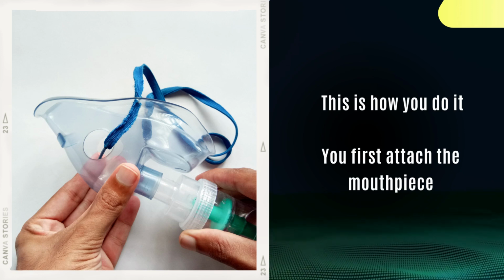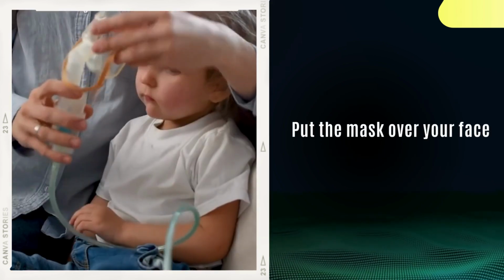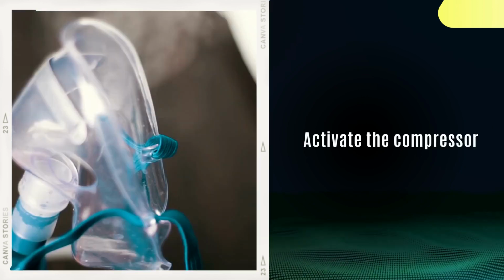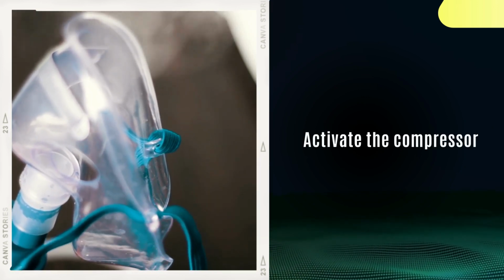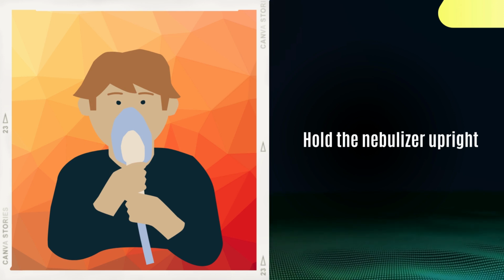You first attach the mouthpiece, then the top piece to the medication cup. Put the mask over your face and firmly seal it with your lips. Activate the compressor. To avoid spills and ensure proper medicine distribution, hold the nebulizer upright.